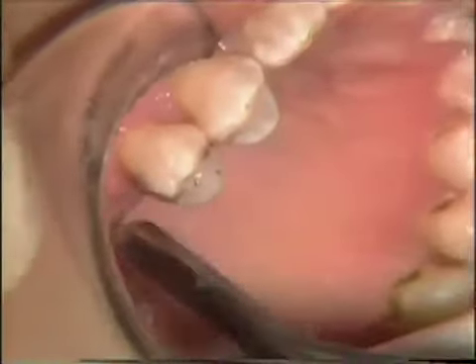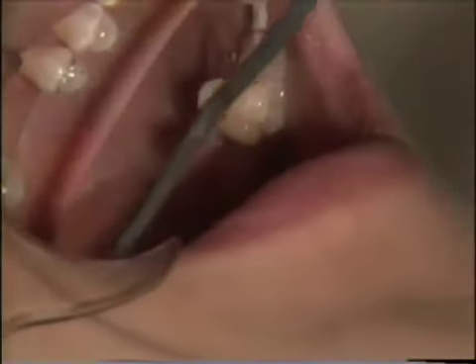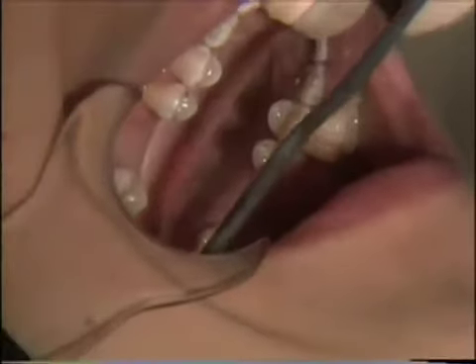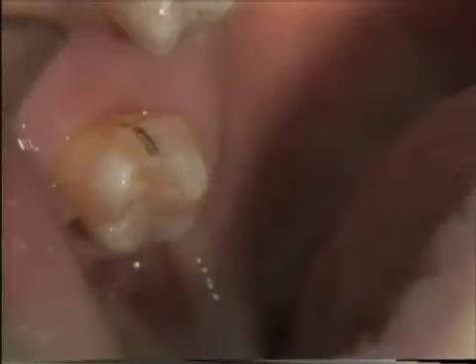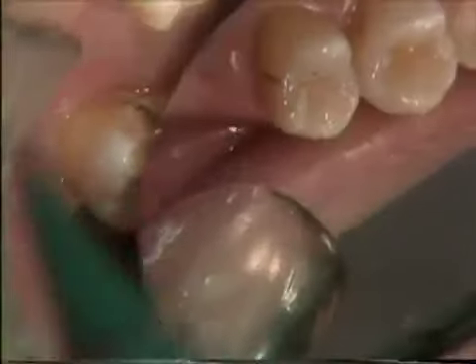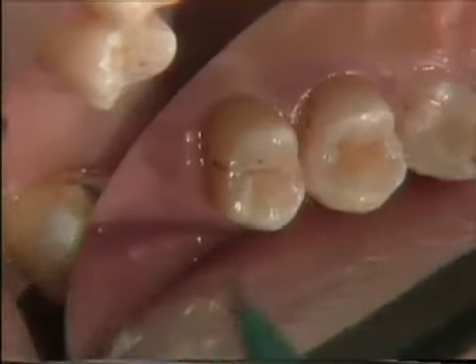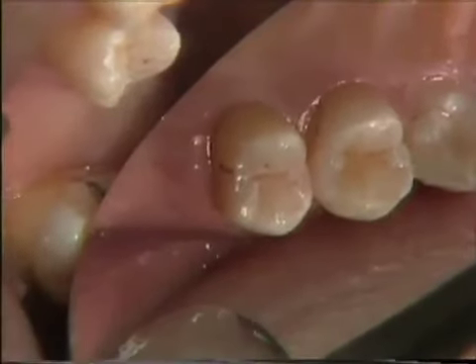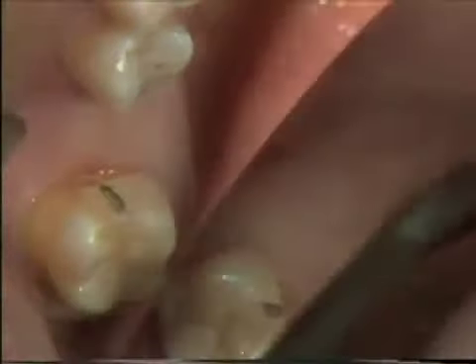With our mirror, we're going to check the draw. Using the front surface mirror, closing one eye, and looking down those two slices, you should be able to see the cervical. We've done our initial preparation — our slicing — and I've penciled in an area where we're going to place the groove, and I've placed one also on the distal of the bicuspid. With the use of the front surface mirror, closing one eye, those two grooves should draw. If they don't, they're erased until the two pencil marks do draw with each other.